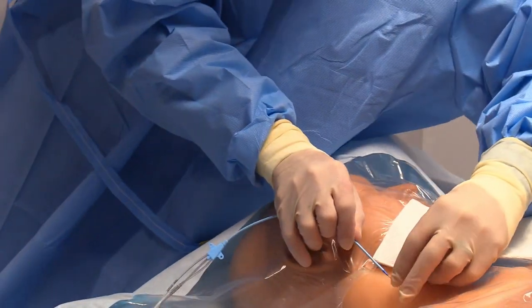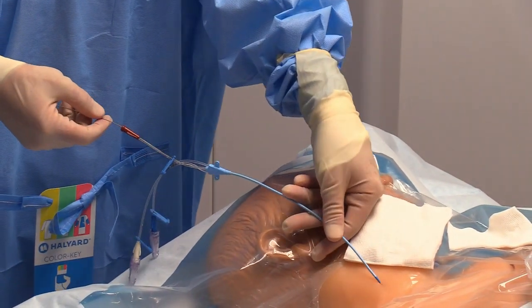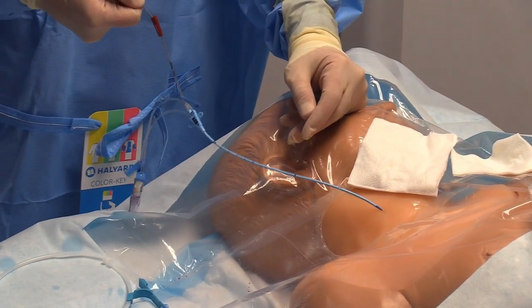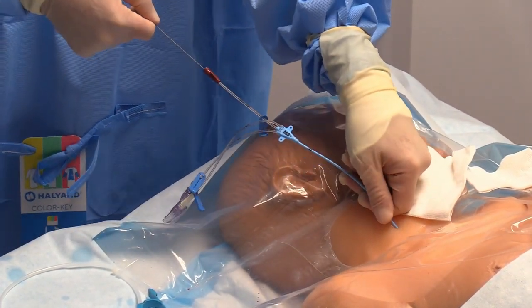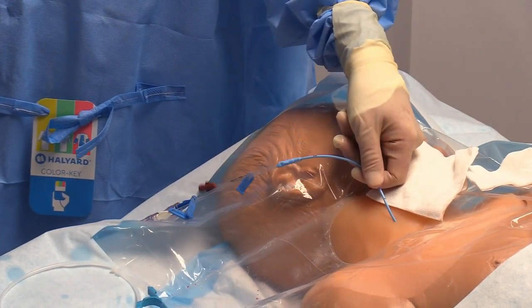So you actually have to grab here and thread it back out the brown end as you thread the catheter in. Once you've got it out the brown port, your right hand can hold the wire like this. Again, the wire should not move. It's just there to be the guide for the catheter, and then thread the catheter over the kit like this. And then once it's into the correct depth, let's say 15 in this patient, then I can go ahead and pull out my wire.